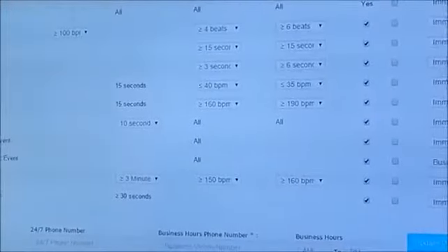Okay. Here we also have notification criteria. This criteria should be put in by the doctor. What is the criticality of a particular arrhythmia and when he wants to be informed.